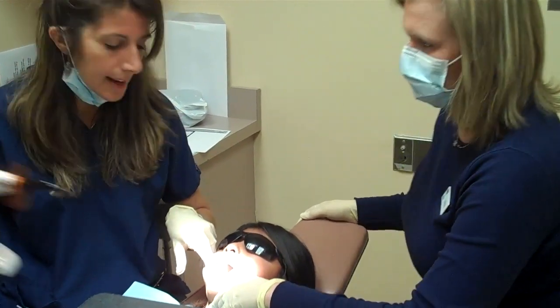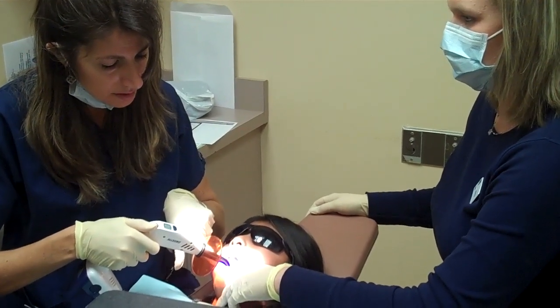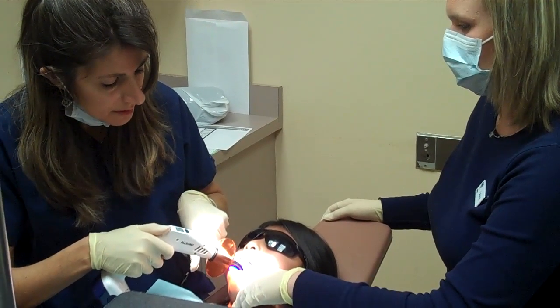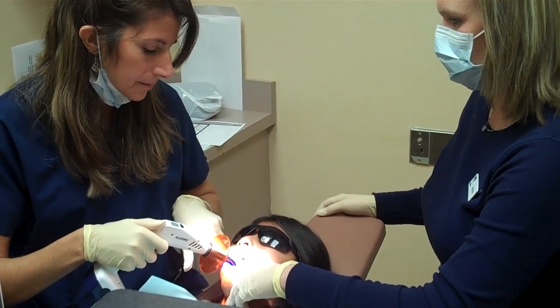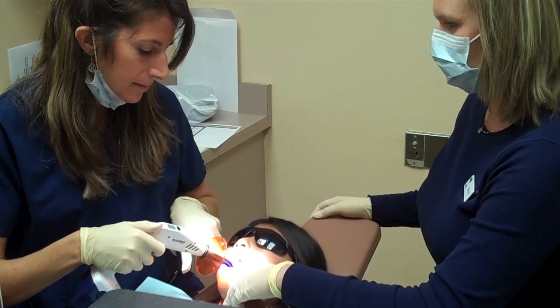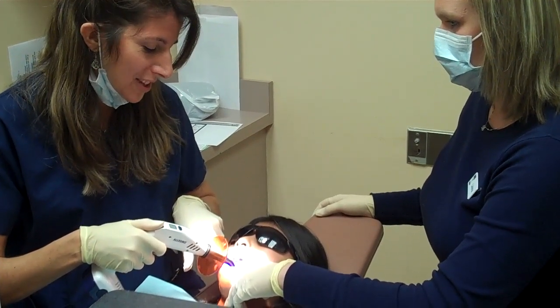After we put the sealant on, we shine a light which is going to cause the seal to cure or harden right into the grooves of the teeth. We're going to do it three times. Now Carlita already had two of these done, she's got one more to go. And look how good she is.